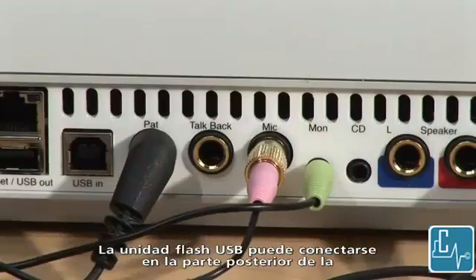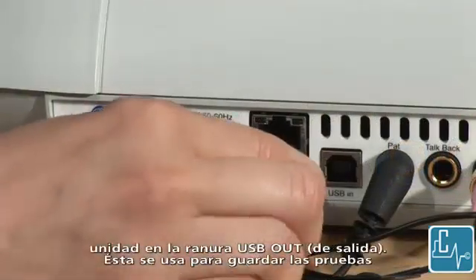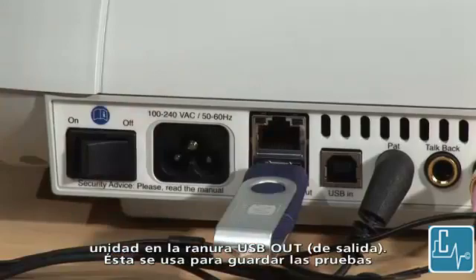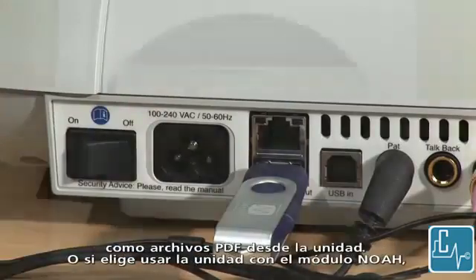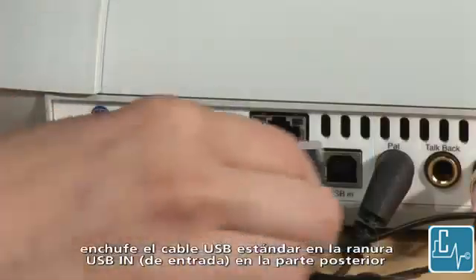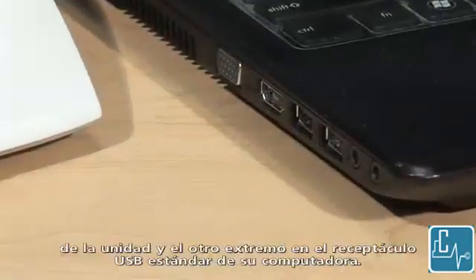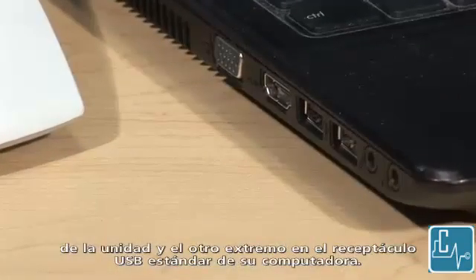The USB flash drive may be plugged into the back of the unit in the USB out slot. This is used to save tests as PDF files from the unit. Or if you choose to use the unit with the NOAA module, plug in the standard USB cord into the USB in slot on the back of the unit and the other end into a standard USB outlet on your computer.